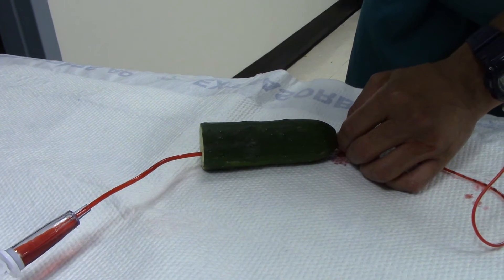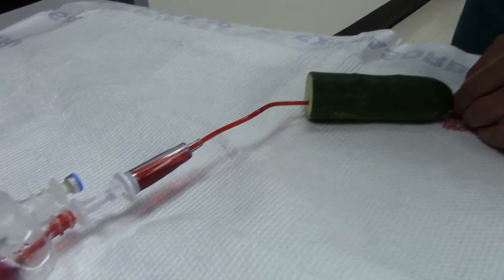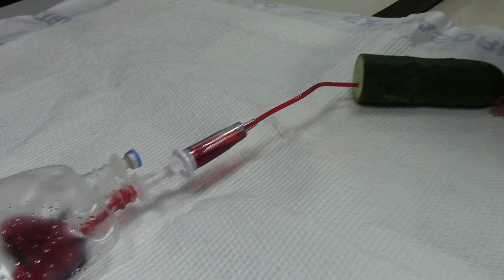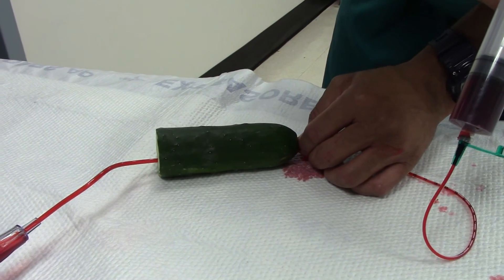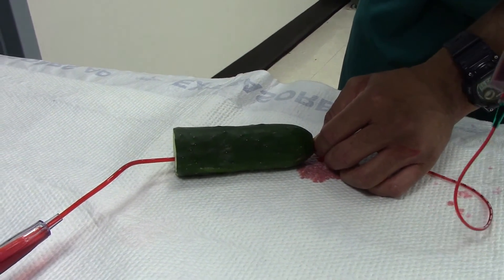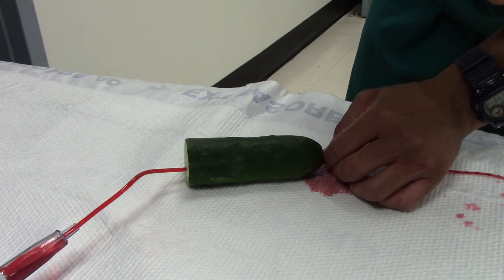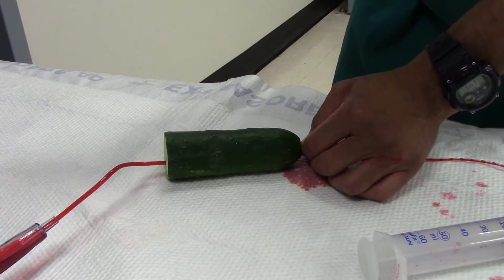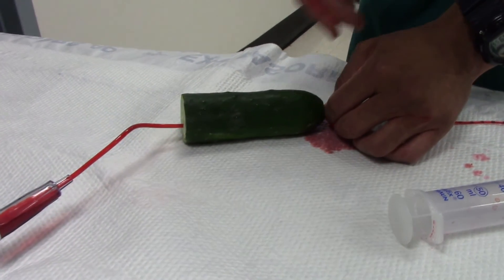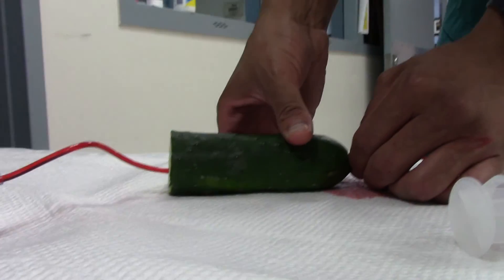Push firmly but slowly to instill the bladder with all of the contrast. Don't push too fast, because you can intravasate contrast into the venous plexus of the bladder. Once all your contrast is in, snap the picture. At this point the X-ray is shot — obviously wear protection — and that's how you do the retrograde urethrogram.